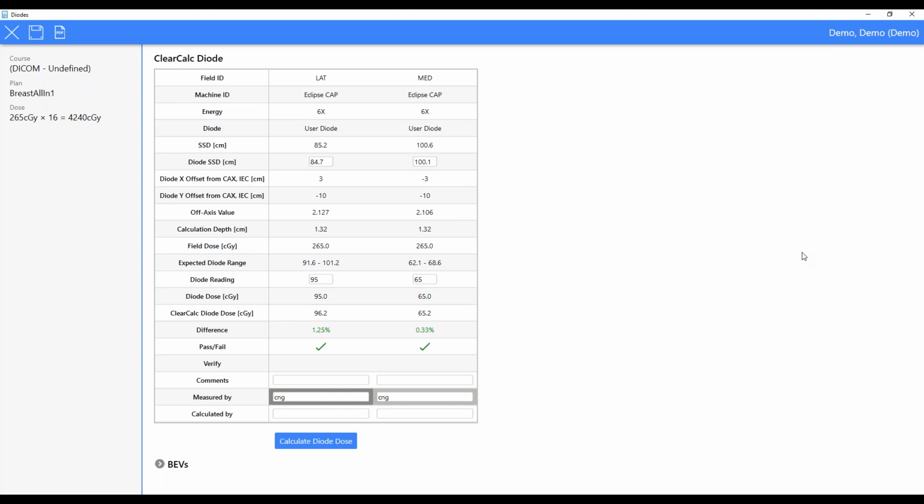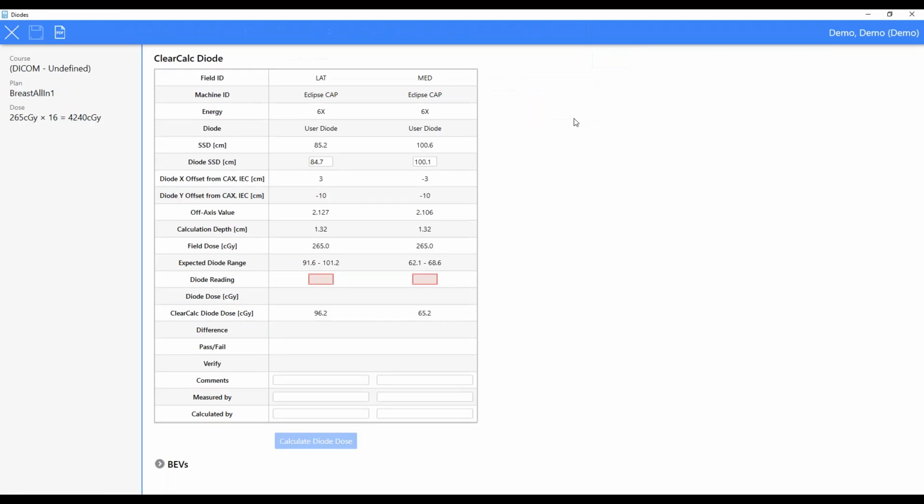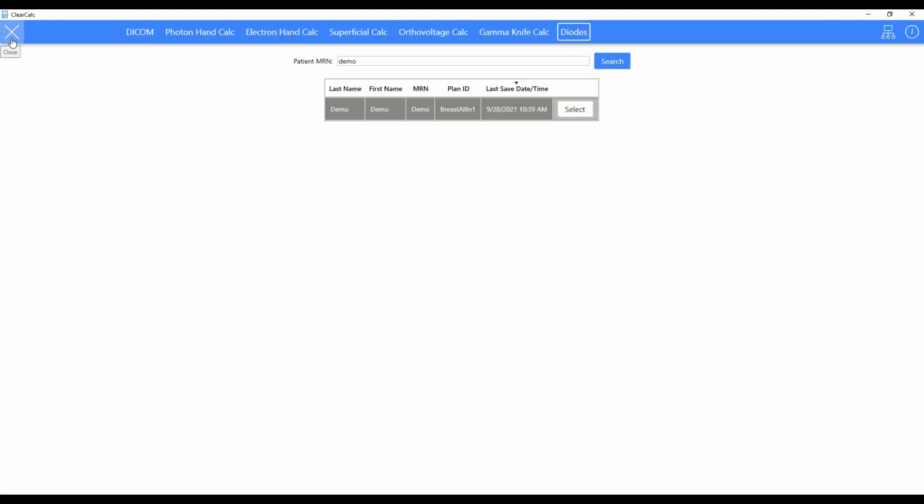Additionally, if they save it here, you can also then come in after they review it and, sorry, I didn't save it. That was my fault. And you'll be able to view the entry that they had. And then if you want to put your initials here as well, that could save to PDF too.